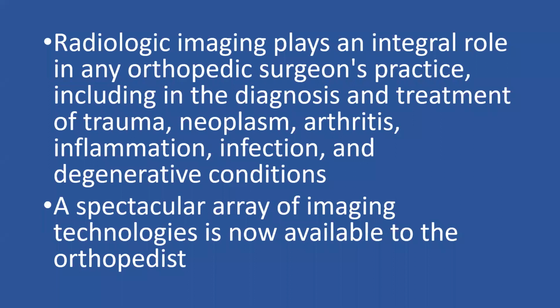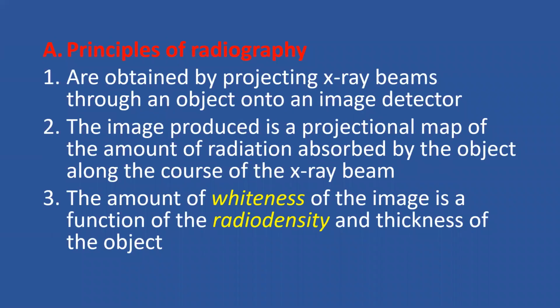There's a spectacular array of imaging technologies, and these are available. But what I'm going to give you today is the essential imaging techniques that we use in orthopedics. We'll start with radiography. What about the principles of radiography?